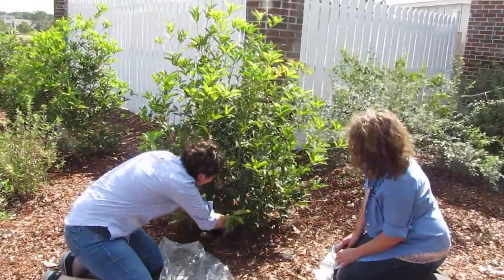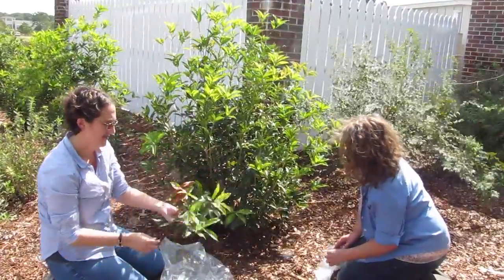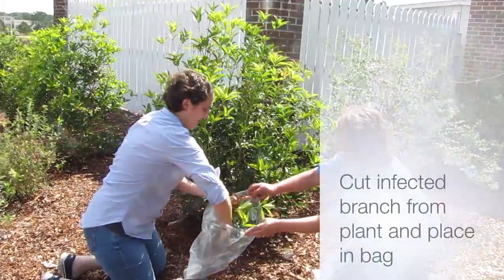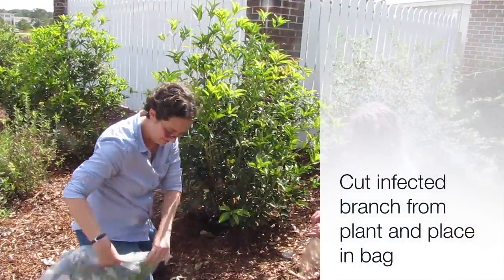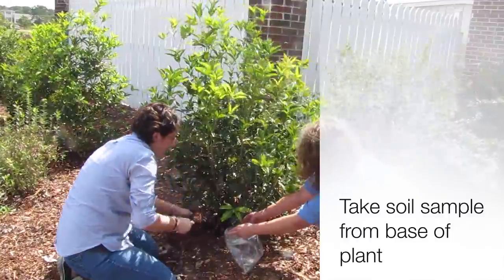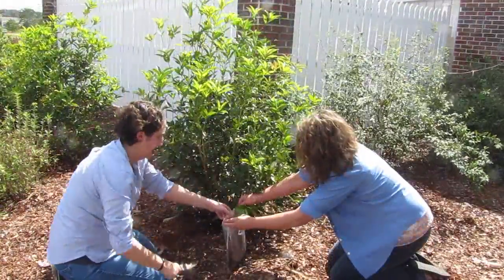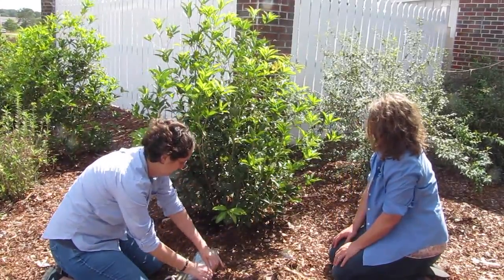When collecting shrub and tree samples, if it's a small shrub or a small tree seedling, we would like the whole plant. But if it's a large shrub or tree, we need portions that represent all of the plant. We need a branch that's showing symptoms, still somewhat alive. We need a soil sample that also includes the feeder roots so that we can look for root rots. And then each sample needs to be bagged separately and placed into a shipping container to mail to us.